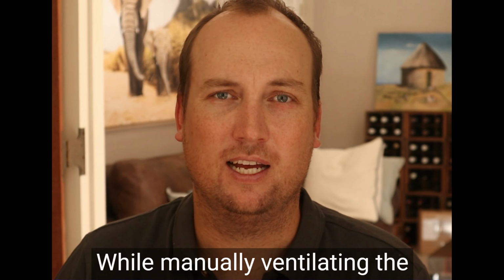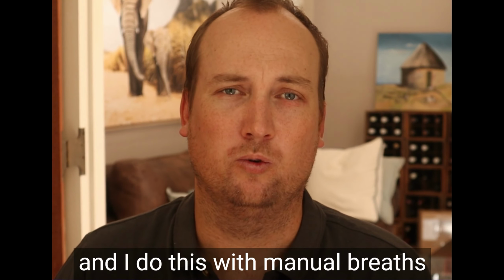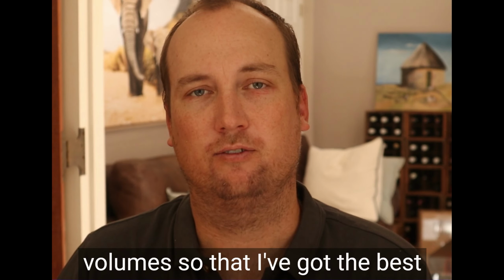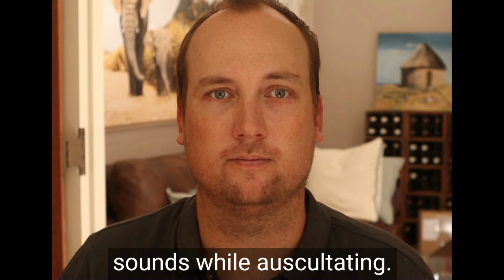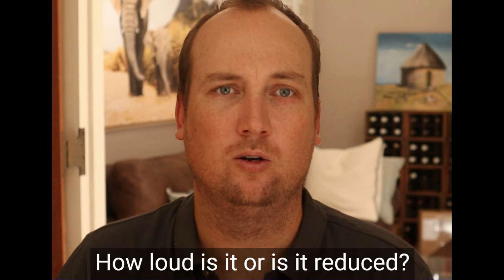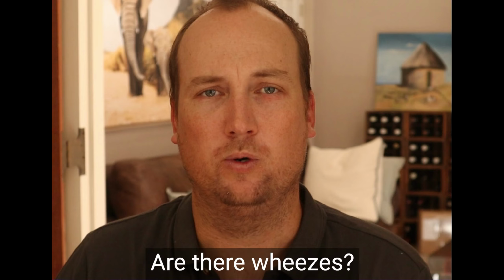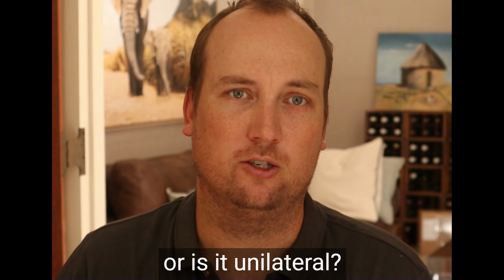While manually ventilating the patient, I auscultate the chest, and I do this with manual breaths so that I can deliver large tidal volumes so that I've got the best chance of hearing the breath sounds while auscultating. What I'm listening for is the quality of the air entry. How loud is it, or is it reduced? Are there crackles? Are there wheezes? Is the air entry bilateral or is it unilateral?